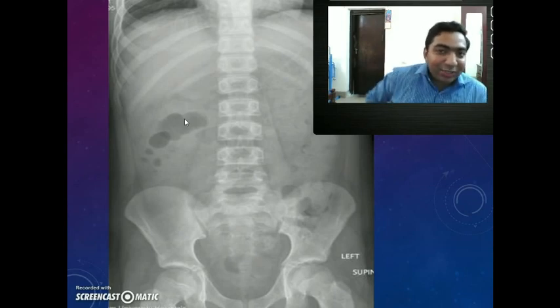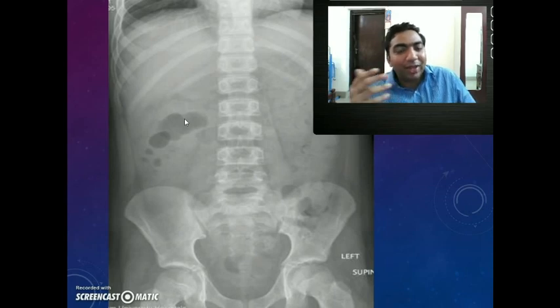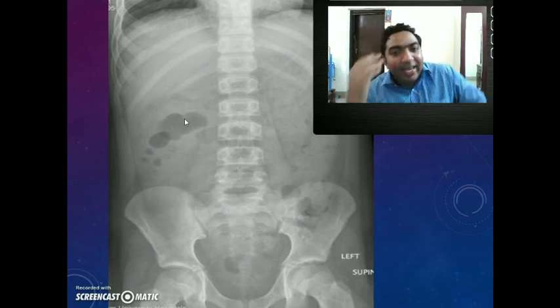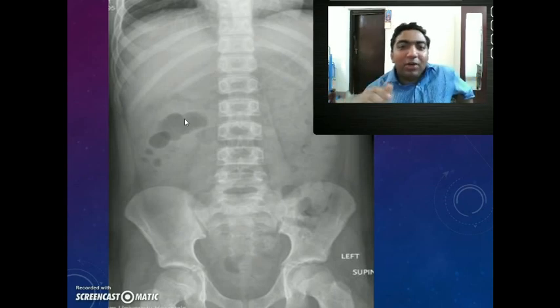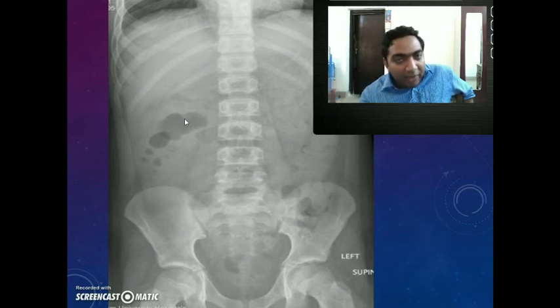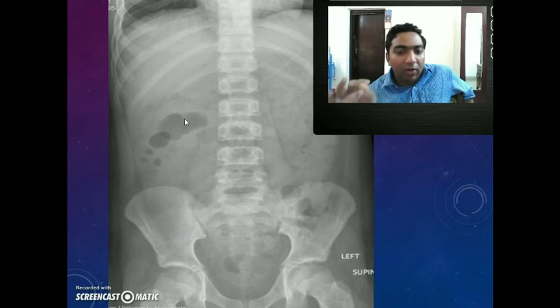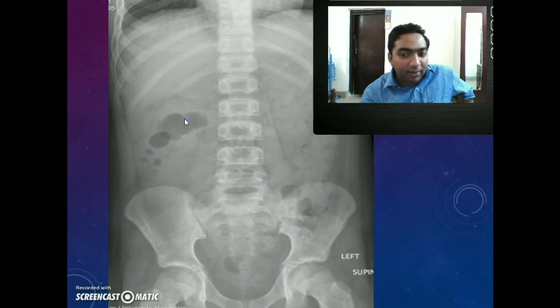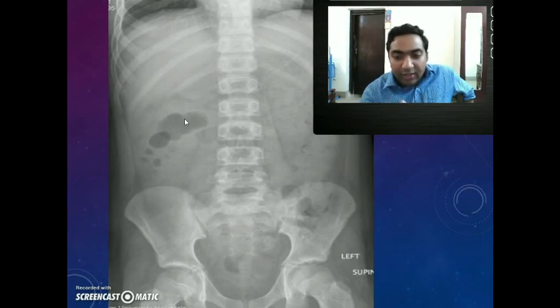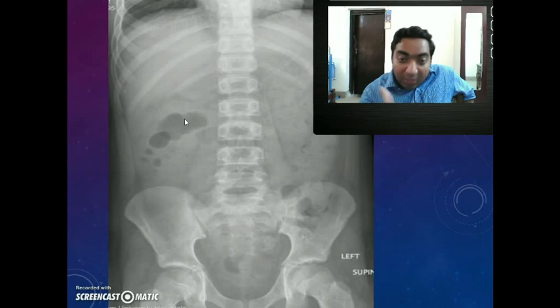It is sometimes very easy to say this, but most of the time our eye goes to the pathology first. In the initial stages, it is virtually impossible not to look into the pathology and proceed in an orderly methodical way. So go for the primary survey and make a provisional diagnosis — let it be air under the diaphragm or air fluid levels, anything. But then go in for the secondary survey where you go methodically from the bony shadow to the soft tissue shadow to the air shadow, going from more white to lesser white and finally into the black, so we will not miss any important findings.